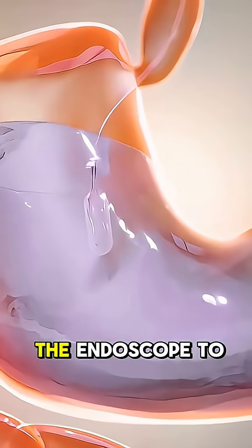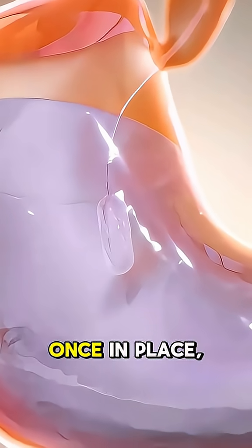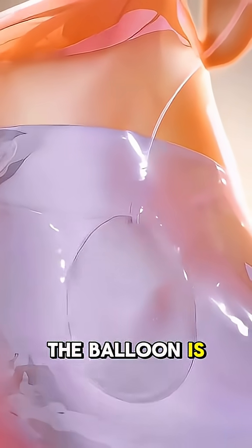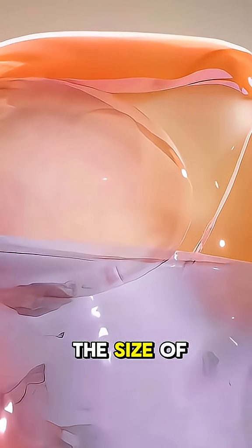The doctor uses the endoscope to carefully guide the deflated balloon. Once in place, the balloon is inflated with a sterile solution, causing it to expand to about the size of a grapefruit.